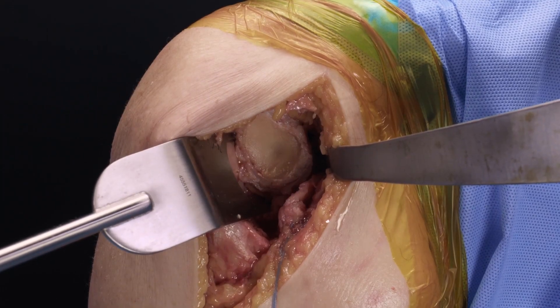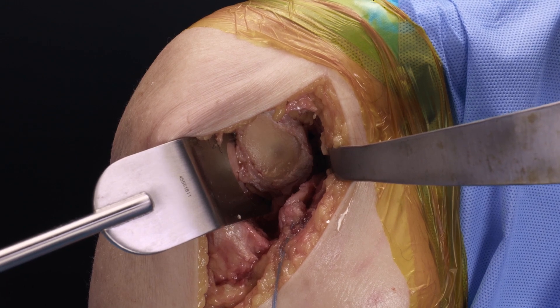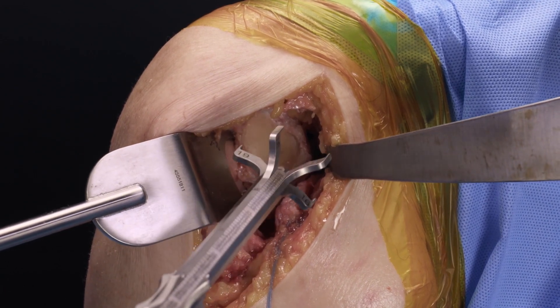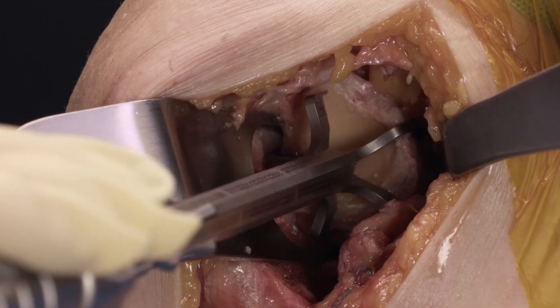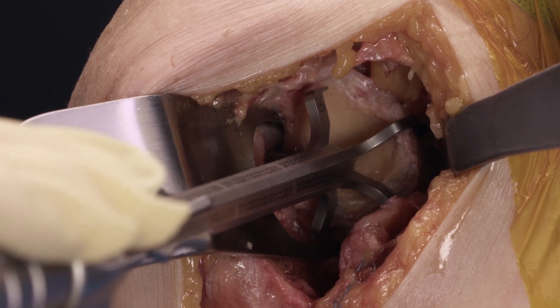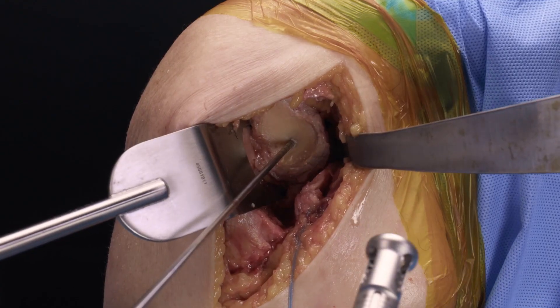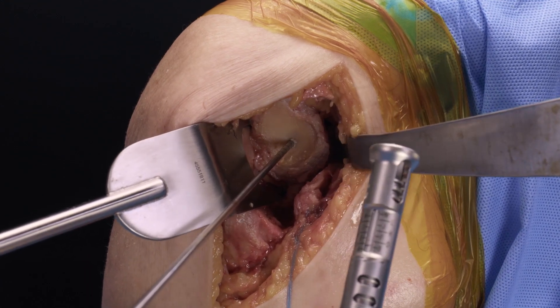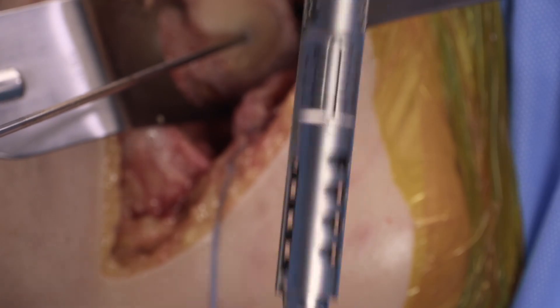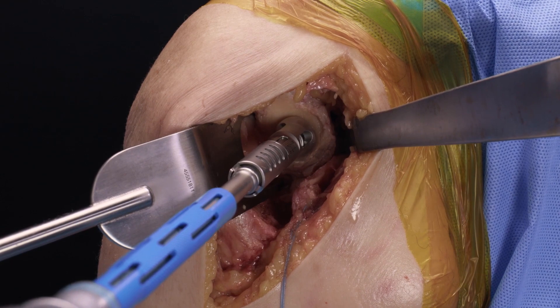I will now demonstrate in a cadaver the use of the VIP glenoid reamer. We've done our standard exposure and capsule releases and have an excellent view of the glenoid. I will now place my guide pin for my standard MGS base plate using the VIP targeter as is typical. Our depth for the VIP pilot reamer is set at C per our VIP plan. Here I'm using the VIP pilot reamer to create our pilot ream hole.